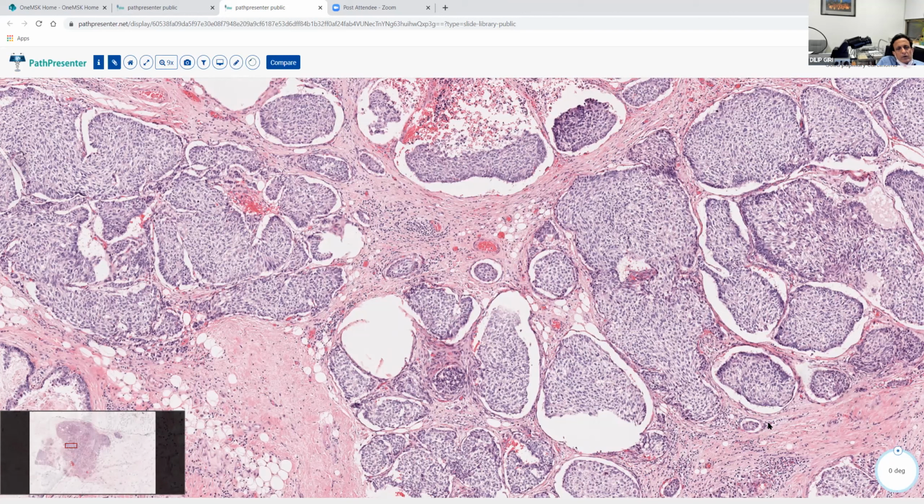So you have to remember that when something expands, let's say in the beginning that lesion around its duct had 50 cells, right? And let's say that the entire duct was 1 millimeter in diameter and had 50 myoepithelial cells around it. In that situation, if you did the myoepithelial stain, it will light up the myoepithelial layer, because you have a small area where there is enough number of myoepithelial cells that the stain is going to pick up.